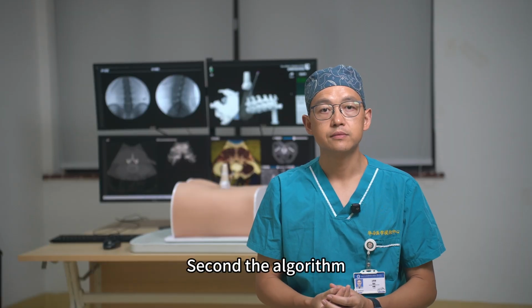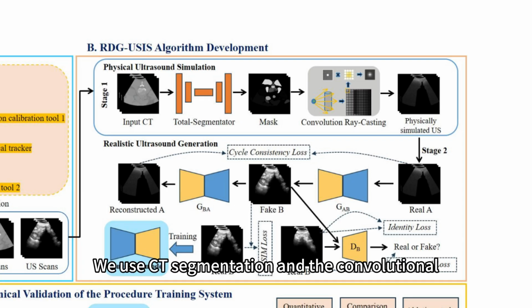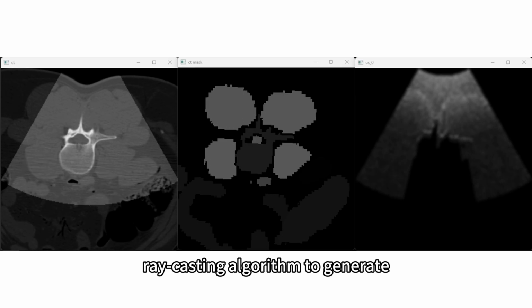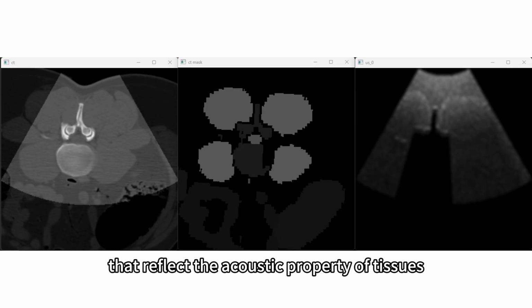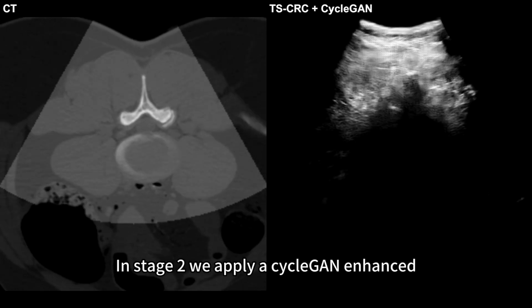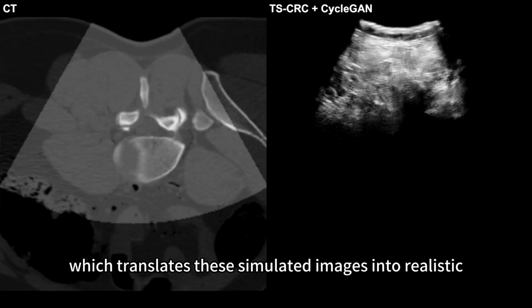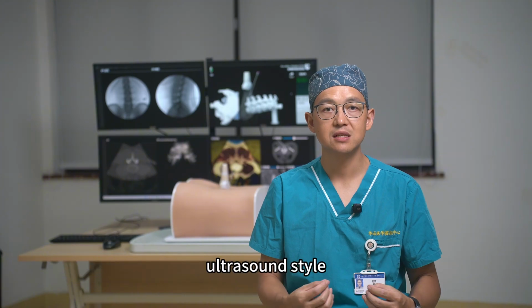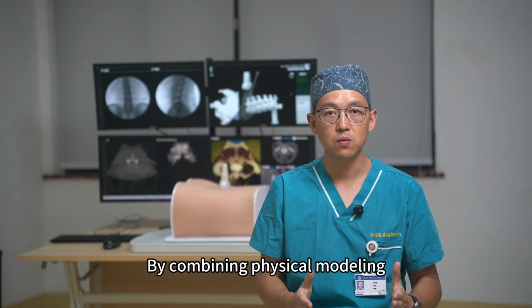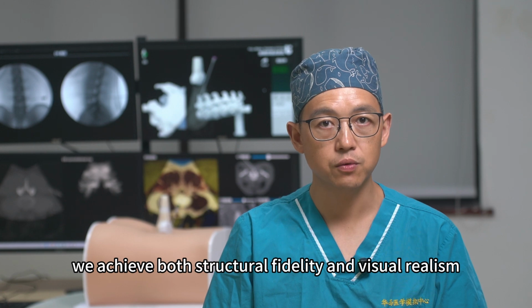Second, the algorithm. RDG-US employs a two-stage simulation strategy. In stage 1, we use CT segmentation and a convolutional ray-casting algorithm to generate B-mode ultrasound images that reflect the acoustic properties of tissues. In stage 2, we apply a CycleGAN enhanced with structural similarity loss, which translates the simulated images into realistic ultrasound style while preserving fine anatomical details. By combining physical modeling with generative translation, we achieve both structural fidelity and visual realism.